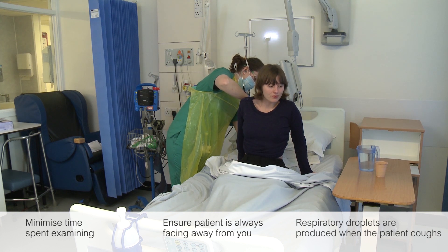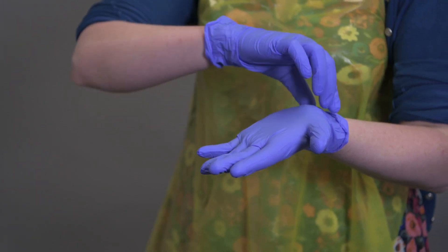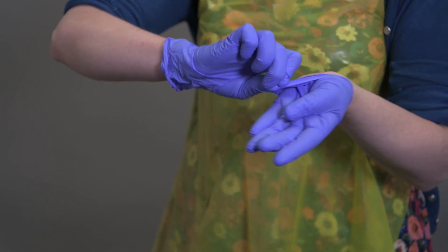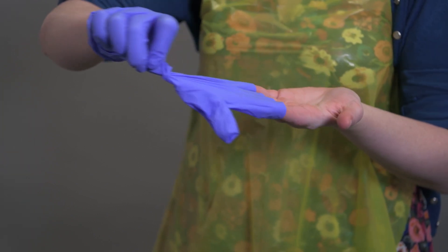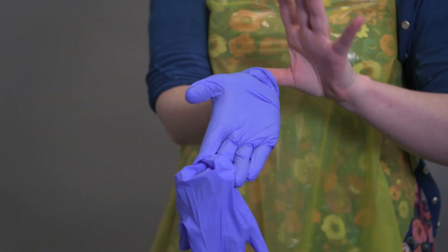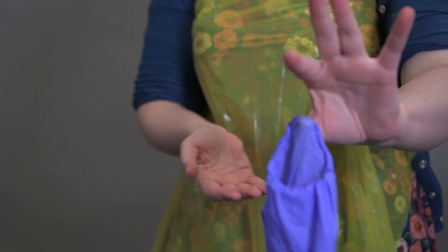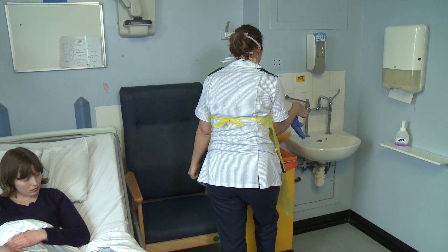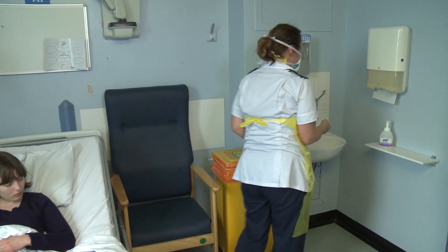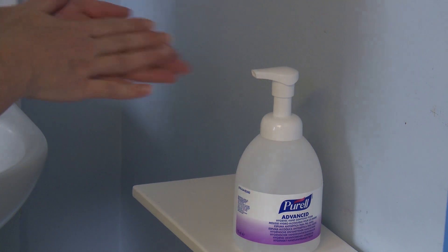Please start removal of personal protective equipment within the isolation room. Remove gloves by grasping the outside of the glove with the opposite gloved hand and peel off. Hold the removed glove in the remaining gloved hand. Slide the fingers of the ungloved hand under the remaining glove at the wrist. Discard as clinical waste. Alcohol gel hands and repeat at every stage of the doffing process.